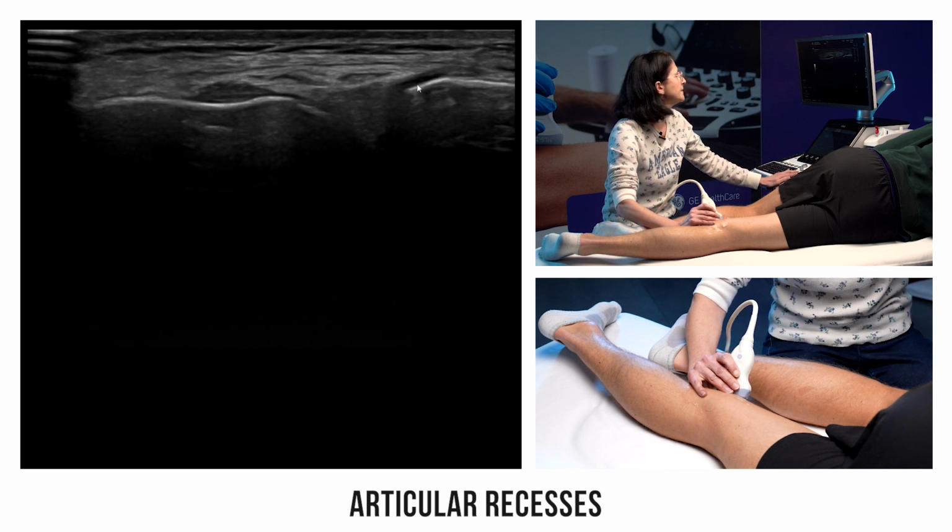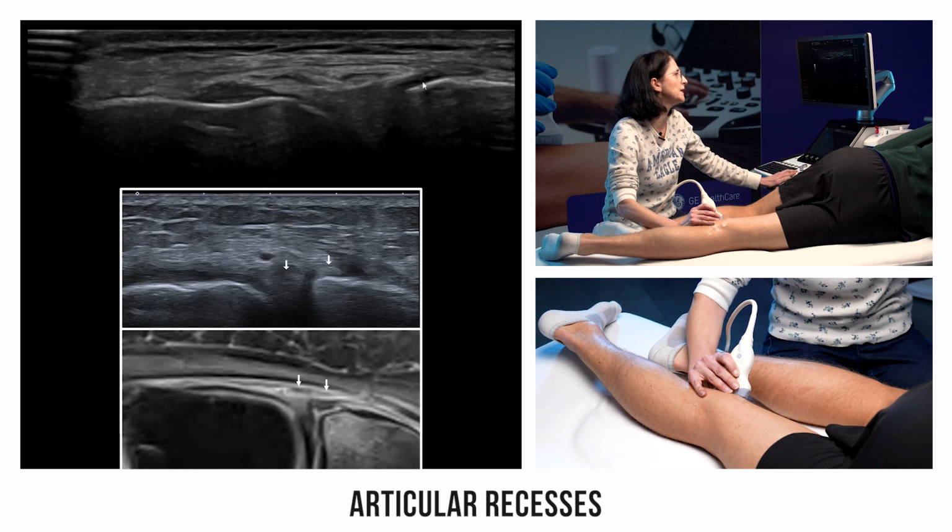If there's a meniscus injury, this is where we look for potential displaced meniscal fragments, either here in the meniscotibial recess or higher in the meniscofemoral recess.